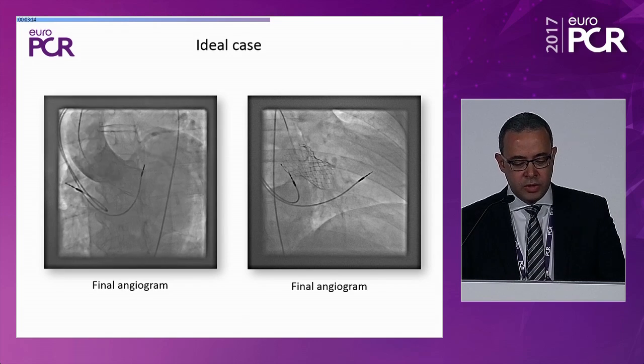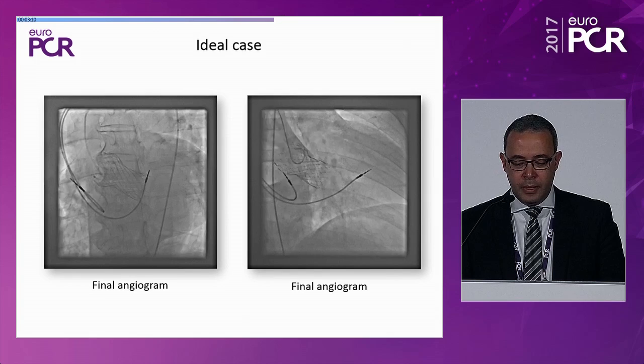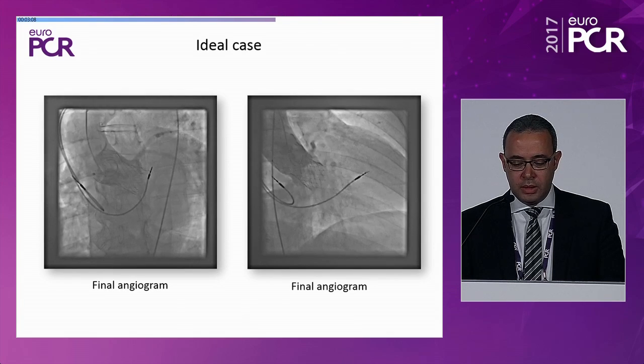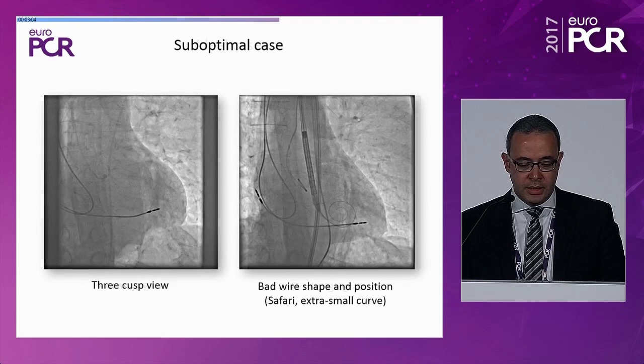In this case, the result, as you can see here, is very nice with almost no aortic regurgitation. And this is really like a case which went nicely and fine.